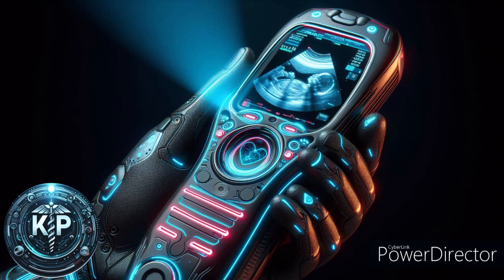Spectrum waveform. In Doppler ultrasound, this is a graphical representation of the flow velocities within a vessel over time. It helps in assessing the nature of blood flow and detecting abnormalities. Color Doppler. This technology assigns color to the direction of blood flow, which helps in visualizing and assessing vascular structures and patterns within the body. These components and technologies enable the ultrasound device to provide detailed and dynamic images of the body's internal structures, which are invaluable for diagnostic and therapeutic purposes in medicine.